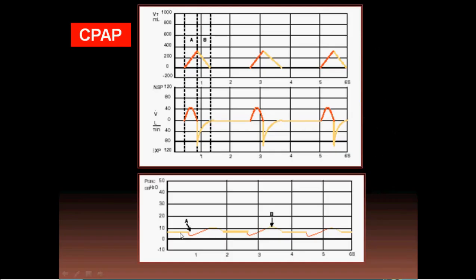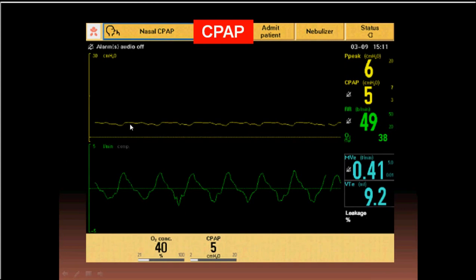Looking at the pressure-time curve in CPAP, it oscillates: when pressure starts to fall during inspiration, flow increases to restore it; when the patient exhales, flow decreases to restore it back. The pressure oscillates around the set value, for example around 8 cm H₂O. The flow-time curve shows inspiratory flow increasing and expiratory flow decreasing, and the volume-time curve shows the tidal volume. The flow increases and decreases to keep pressure constant throughout both inspiration and expiration.